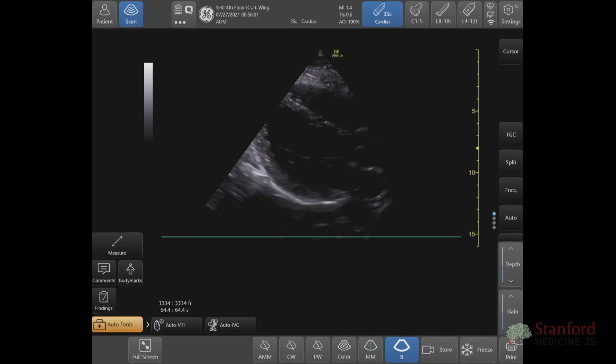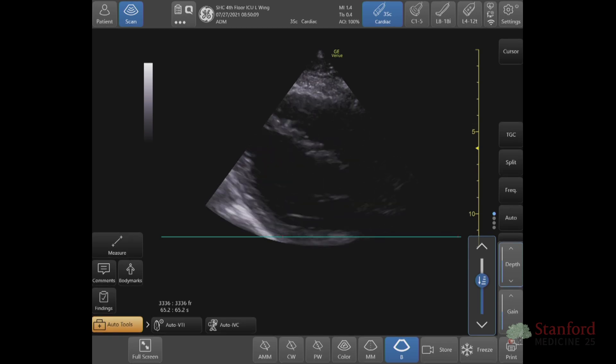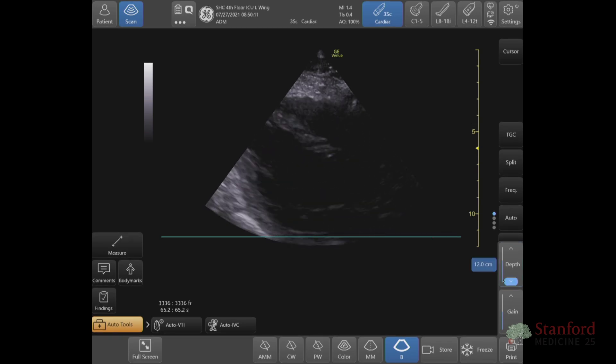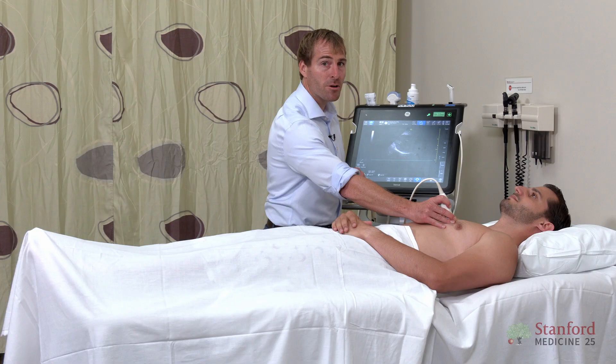We need to be able to adjust the depth. Every machine will have depth. Let's say I want to bring it in a little bit — I want to make the beam not go quite as deep. I press the up button, or I press the down button and I can look deeper into the chest. Pretty straightforward.